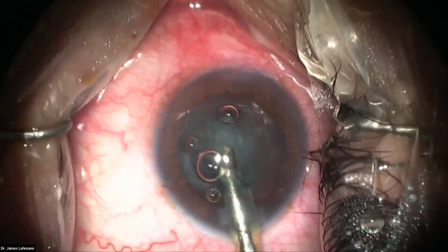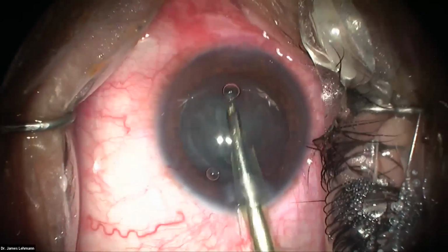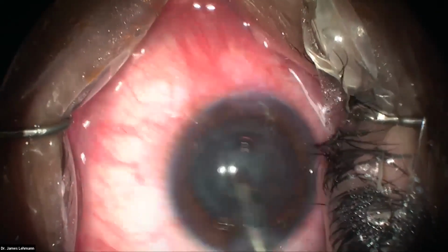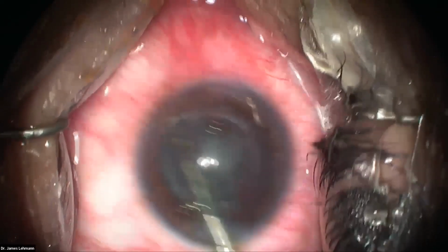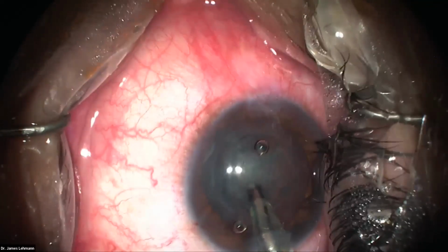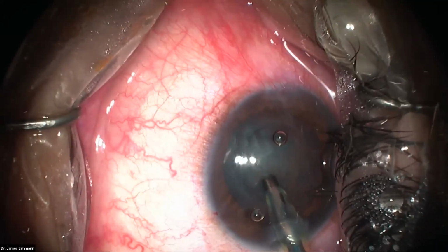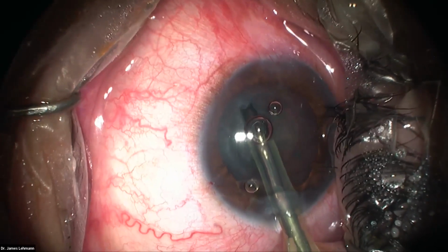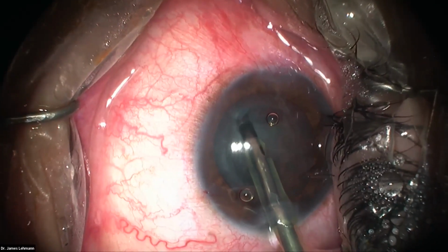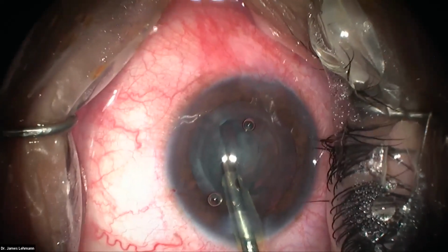Okay, now I'm going to my second foot position, and I'm just going to remove these bubbles and a little bit of that cortical debris to help clear up the view a little bit. Okay, so now you see a bubble over here. You see that central line. So I'm going to follow that central line. And so you can see it's already been pre-fractured with the laser. Okay, so I'm about 80% there.